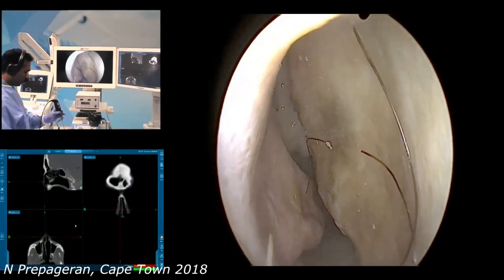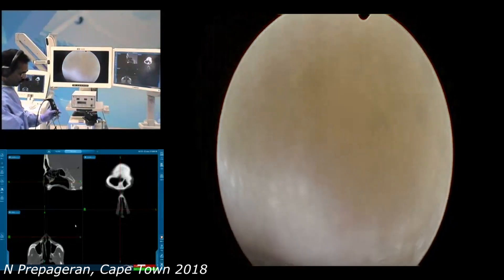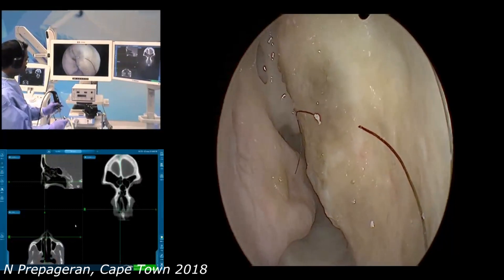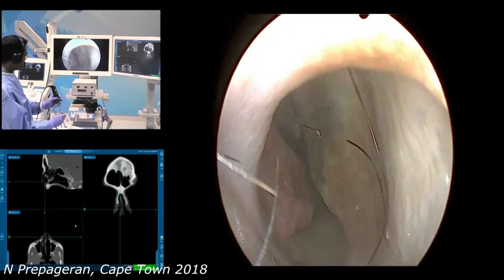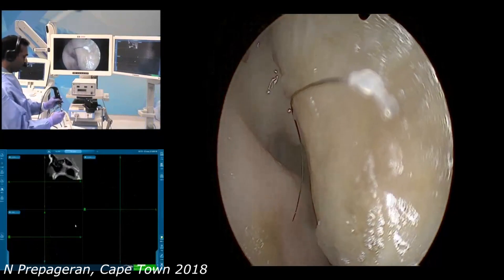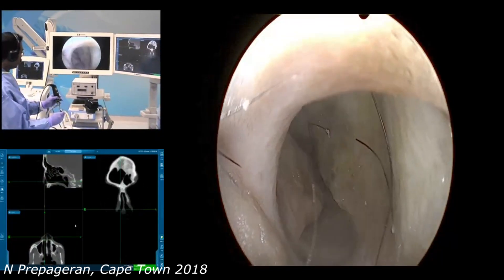Whenever you hold the scope, you want to make sure the scope is anchored right at the tip of the alar cartilage here, so that your other instruments can slide under it like this. What is important is: whenever you introduce an instrument, you withdraw your scope, put in your instrument, and follow them together. What you do not want to do is have an instrument already inside and then blindly insert a suction or other instrument where you can't see where it's going. I think that's a very important step.